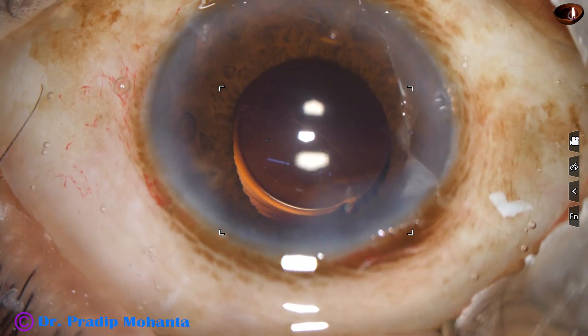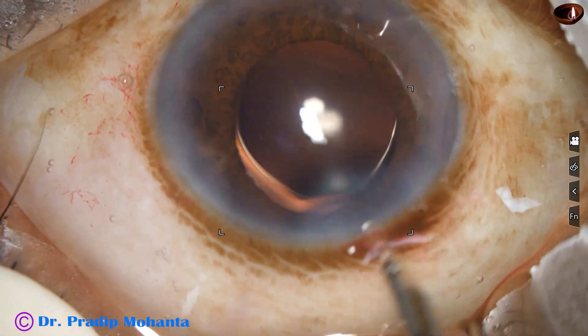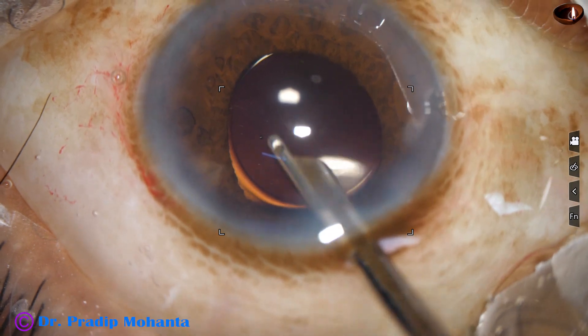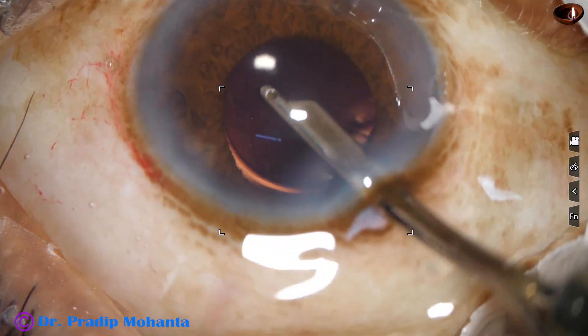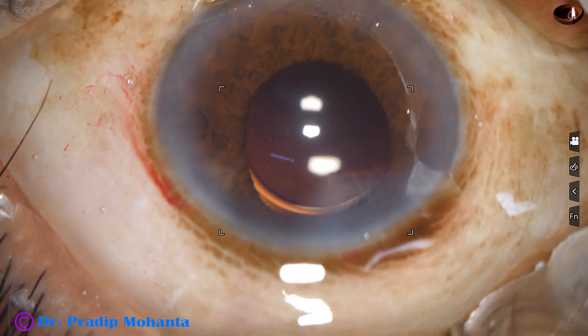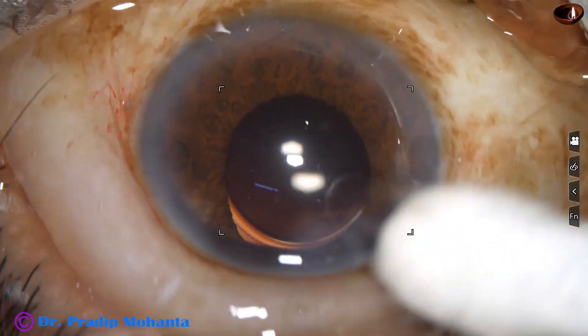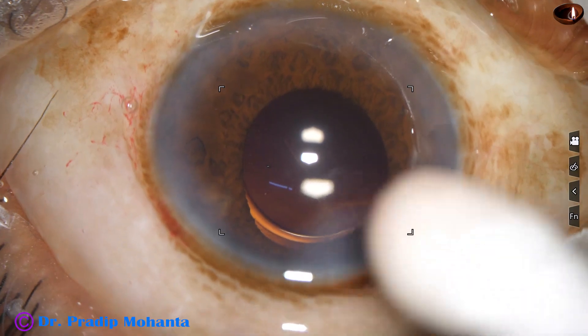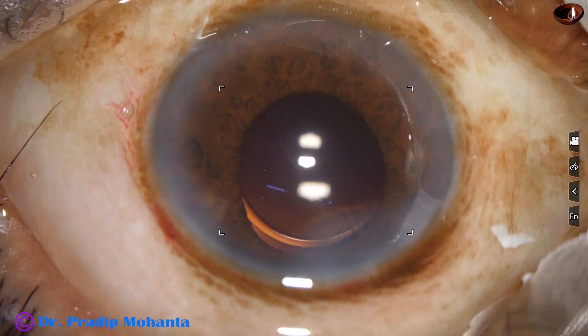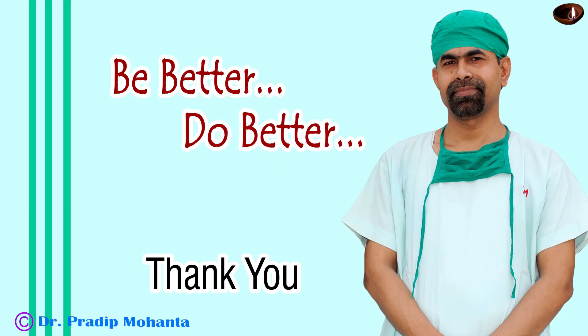The main wound has been constructed in such a way that it does not require any hydration to close. This is the final lavage of the anterior chamber to reduce the incidence of TASS. The anterior chamber is nicely formed. Integrity of all wounds is checked with a cotton-tipped applicator. A few drops of moxifloxacin are applied over the cornea and the case is concluded. Thank you very much for your attention. Hope this video will help you in developing your surgical skills. Be a great surgeon and serve your patients with love, respect, empathy, and great surgical competence.